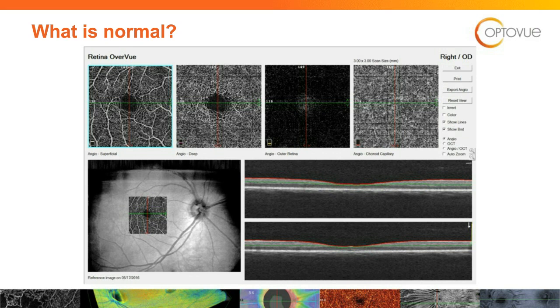The two on the left are what I evaluate clinically in patients with diabetes, diabetic retinopathy, vein occlusions, artery, retinal vascular disease. You want to pay more attention to the two on the left. The two on the right are more for your outer retinal pathology, things like macular degeneration, maybe histoplasmosis if you suspected a CNVM, pathological myopia, central serous chorioretinopathy, again, if you suspect a CNVM. Those types of conditions that cause outer retinal pathology, you're looking for the two on the right, the development of an abnormal vessel that shouldn't be there. So those are your 4 slices.